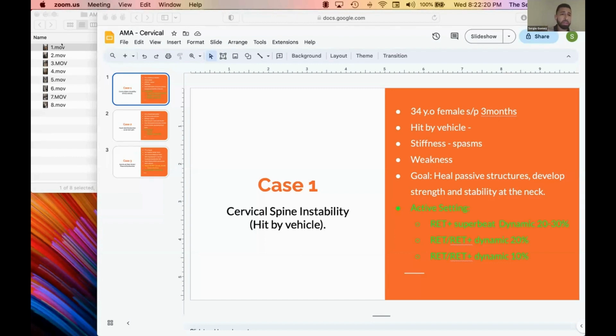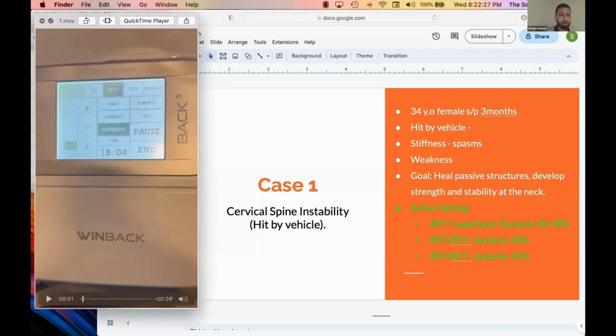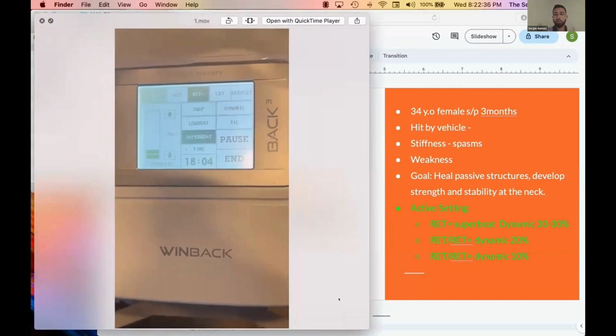I wanted to show you initially how we went about using some of the treatments here. The first clip I'm going to show you really highlights an example of what you can do with a patient. We have other tools, right? So you can have tools like the one I'm about to show, like a Theragun, and you're looking to maybe decrease muscle tone. She was having spasms through her upper traps and levator scapulae.